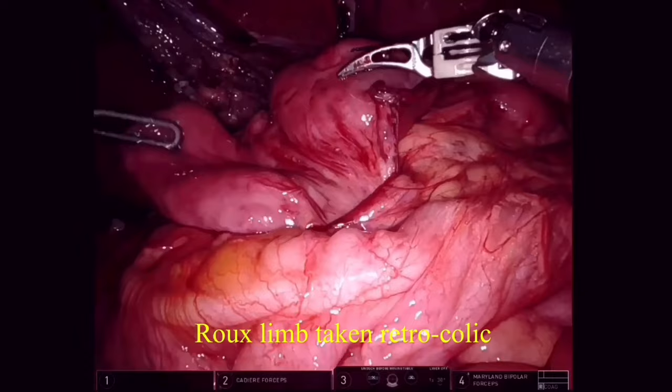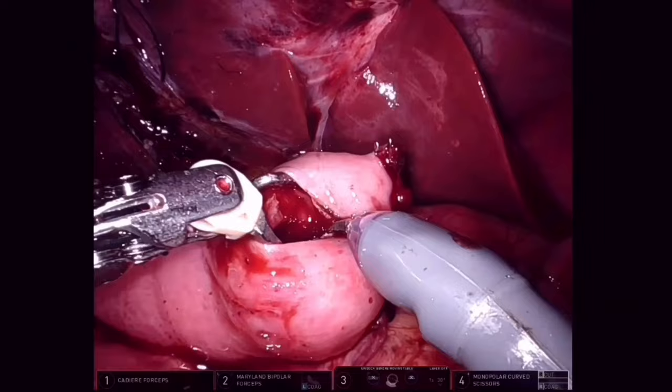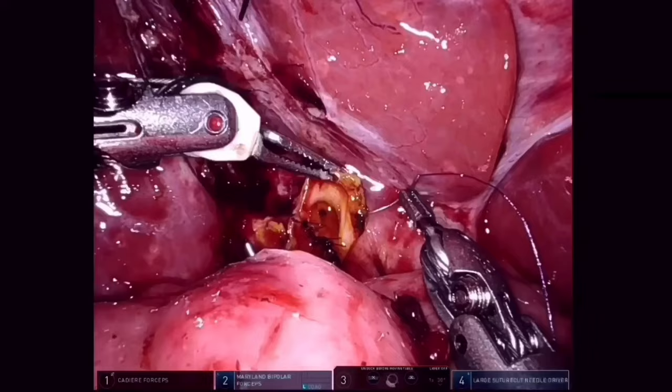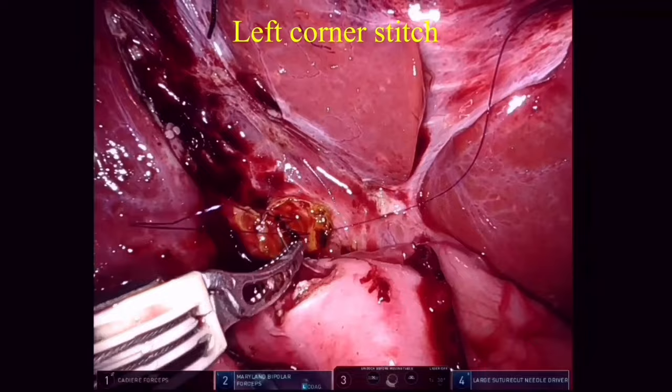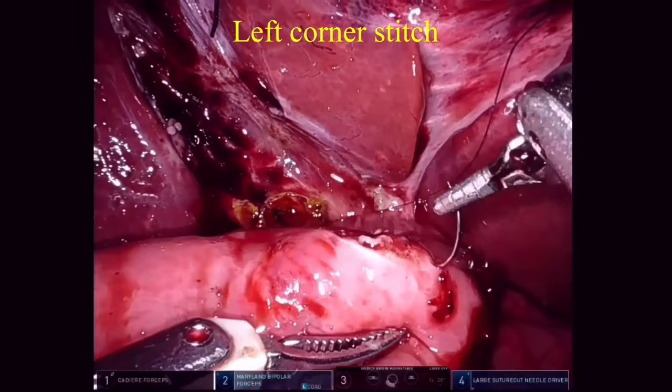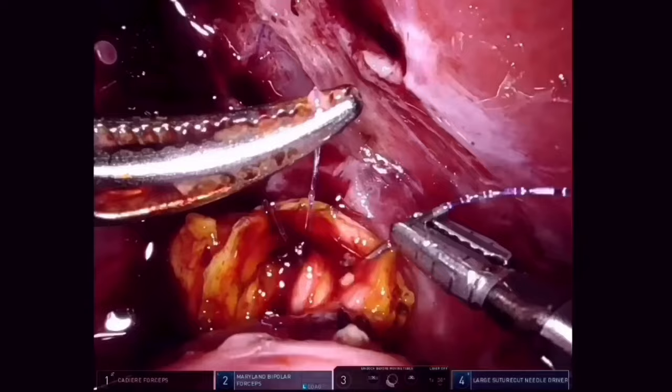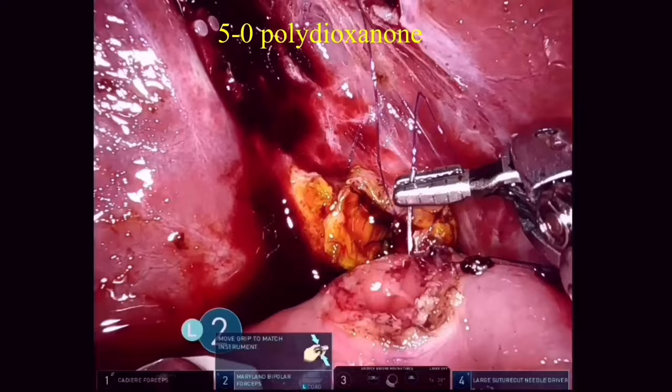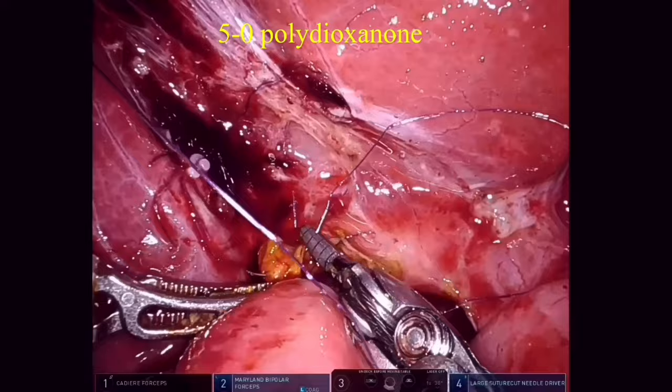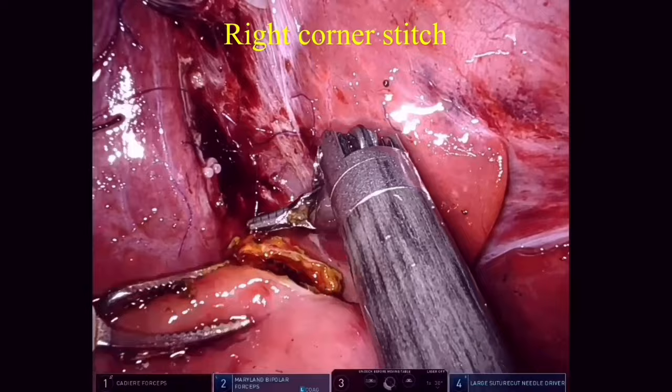A retrocolic window is created and the Roux limb is taken to the supracolic compartment via the mesocolon. A jejunostomy is made in the Roux limb. The hepaticojejunostomy starts with a left corner stitch. We use interrupted sutures on both the posterior and anterior layers, usually with 5-0 polydioxanone. It is very important to place sutures on either side of the common wall between the right posterior sectoral duct and the common hepatic duct.